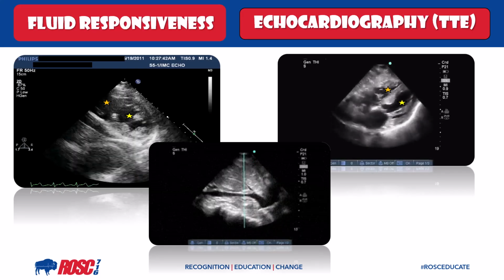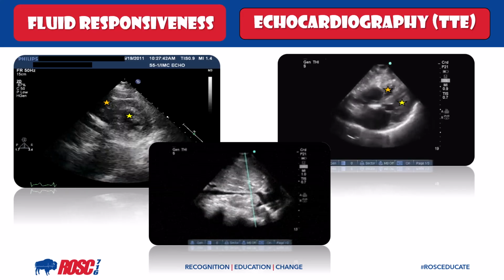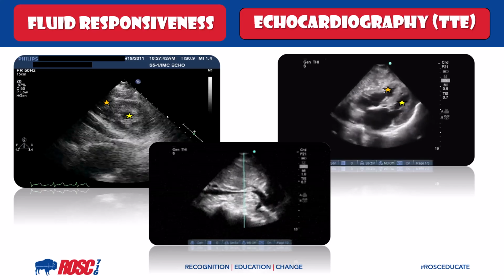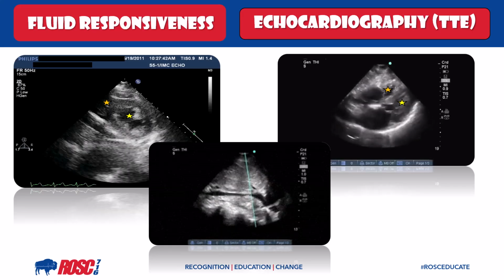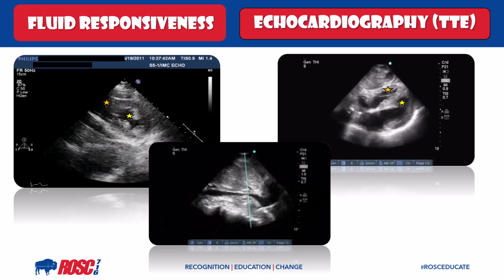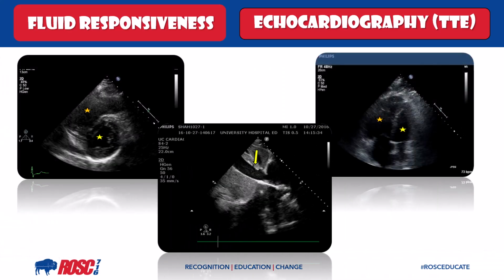These images are a good example of looking at the IVC, but also comparing it to the other echo windows to support your diagnosis of hypovolemia. So in the setting of appropriate history and clinical exam, if I see these echo findings, I do feel the patient is most likely fluid responsive. Now let's take a look at a situation where you should not administer volume.